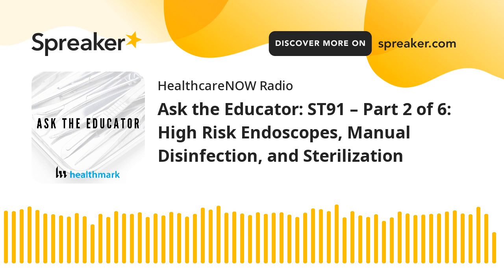You are going to get way more volume of fluid at a higher velocity flushed through those channels. You have controls that make sure it's the right temperature and pressure, as I said, and the right contact times and the right rinsing and all of that. We cannot do the same quality of job every time in all circumstances that a machine can do with this process. So again, we no longer recommend manual at all unless it's an emergency case situation. Look what just happened with the hurricane, right? A lot of facilities were out of power. What if your backup generators go out too?